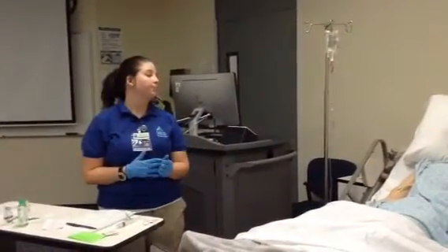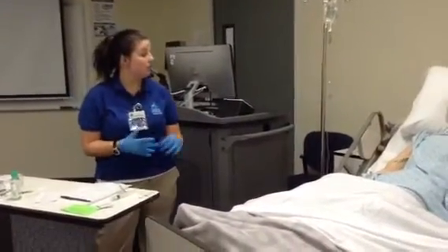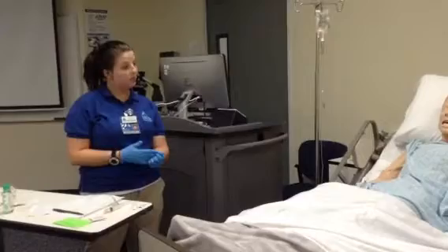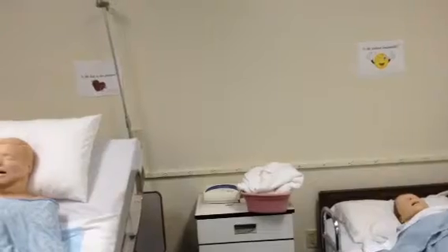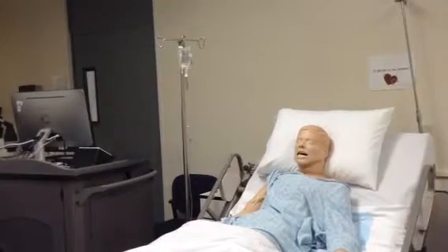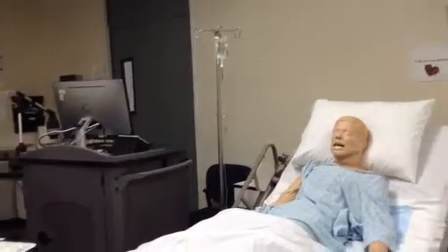Alright, I'm going to go ahead and let your medication drip for an hour as it's supposed to, and I'll come back and assess everything and see how you're doing in an hour, okay? So I'll leave. Before I would leave, though, I would take off these gloves because I am leaving the patient's room. Document that I've administered my medication, and then I come back in my hour.